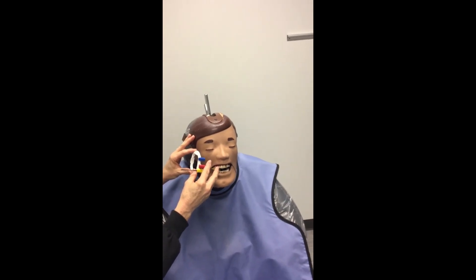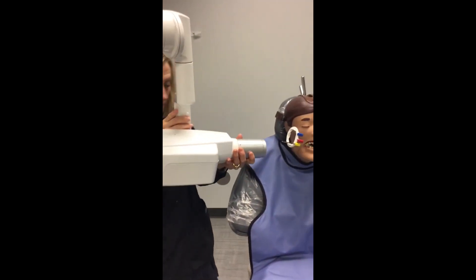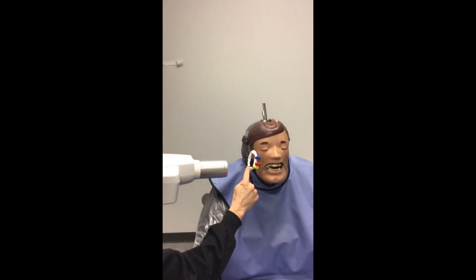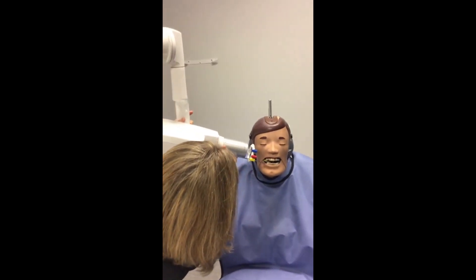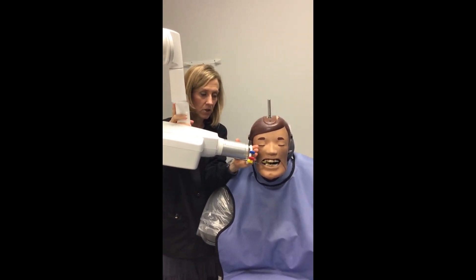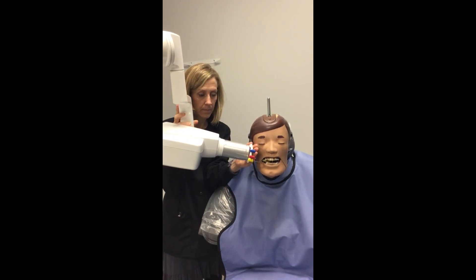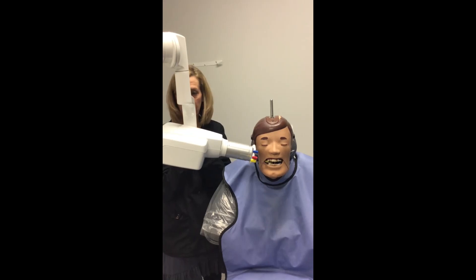The next thing you're going to do is take your tube head. The line on the side should be parallel with your arm — that's the first thing to get. Your vertical is taken care of, so all you need to do now is get it flush left to right. Then you're ready to make your projection.